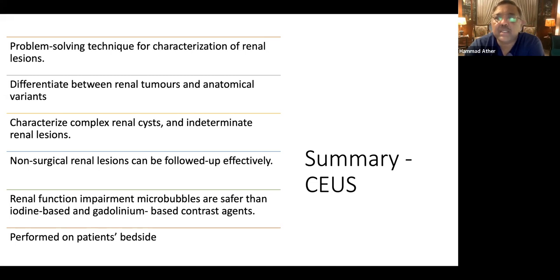Obviously, if you have missed that, these are very fine and subtle changes that you need to observe. The pictures and the cases that we have shown are very classical things. Life is not that simple in a real life situation. It is much more complex.